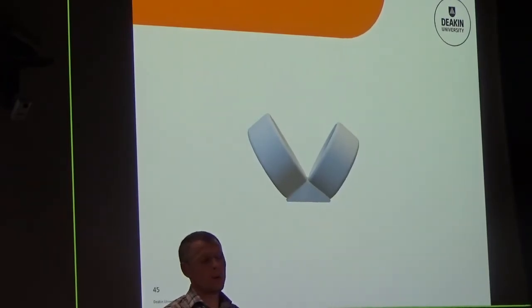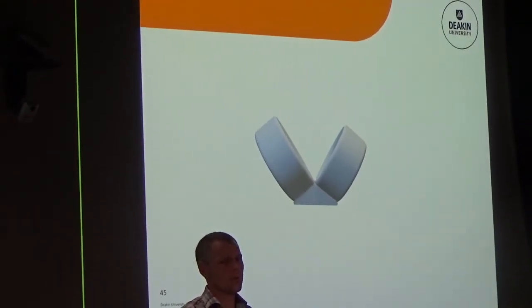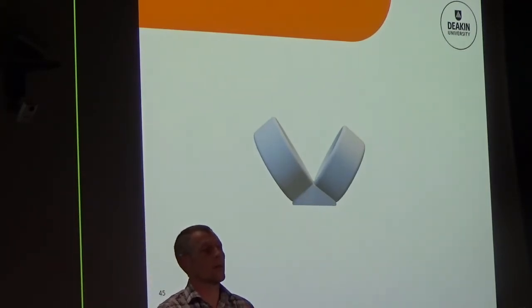So that's what people are looking at doing this for, more chronic conditions. They say we've created this splint for you, and we'll store it in your file, and then next time you come back and you've broken your splint or it's worn out after 2 years, we'll review and make sure everything's the same, but we can modify and reprint it. But where we store that information is very important. Storage of digital stuff is extremely important. Some people are talking about giving it to the clients as an ownership, so they have it and bring it back whenever they come next. But yeah, very big issue.